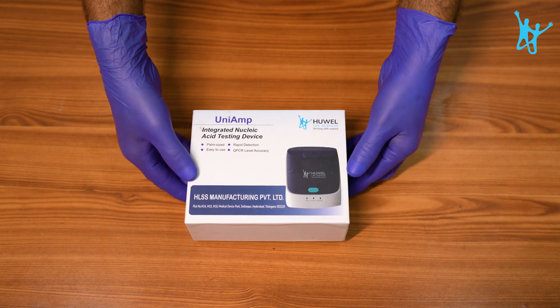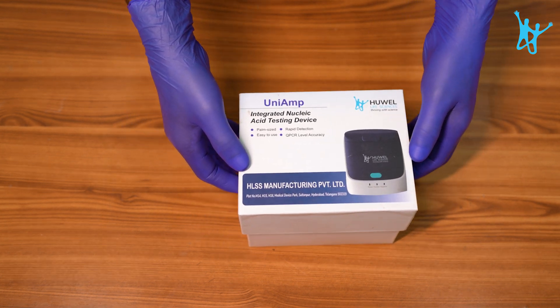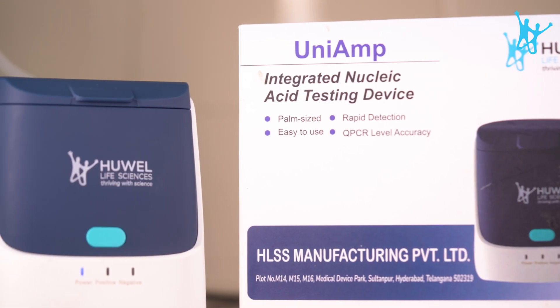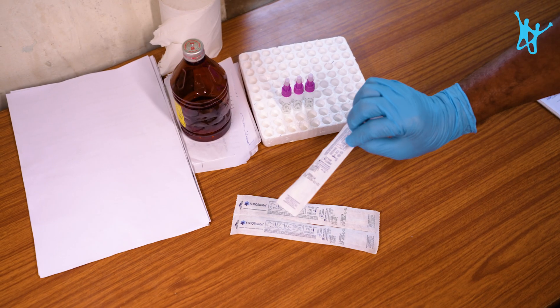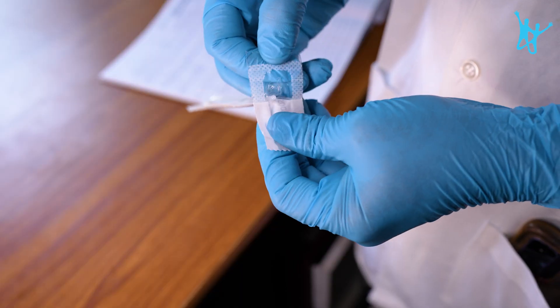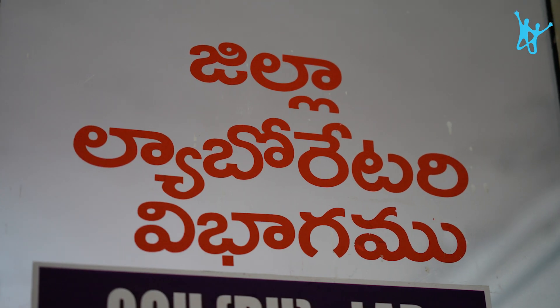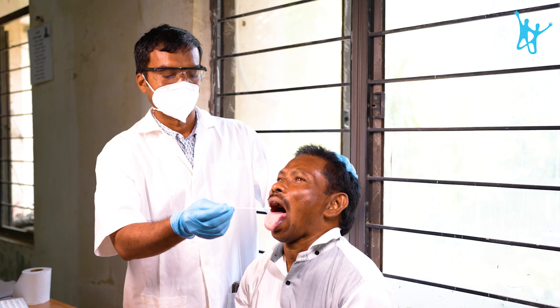All the worries can be put to rest with this simple device. A true doctor's aid, UNI-AMP is a compact, user-friendly NAT device. In just a few steps, it can detect diseases with qPCR level accuracy in less than 30 minutes.